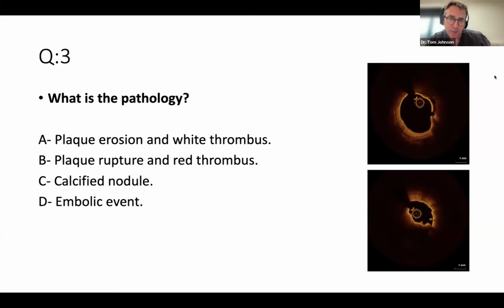You see it a little bit across this very intense signal that you have on the lumen surface from about 10 o'clock right the way around to 3 o'clock. And again, if you trace in a straight line from the center of the catheter, you see that there's this kind of shadow that extends out in a line from the center of the catheter out beyond the scope of the catheter, beyond the scope of the image.